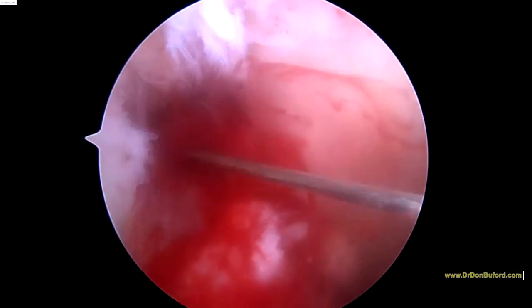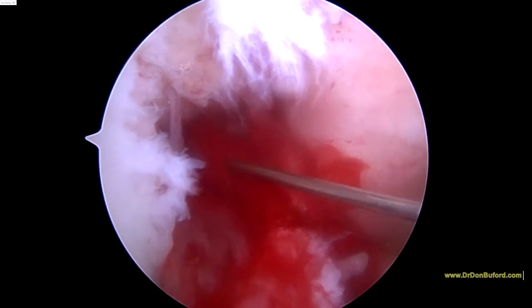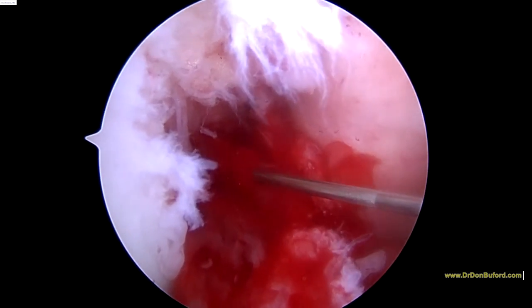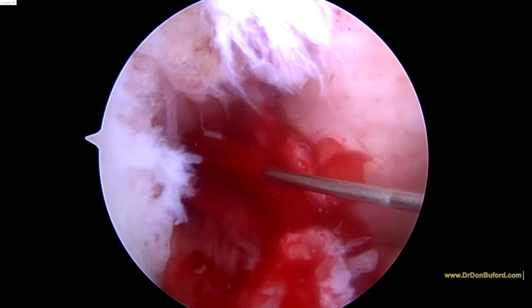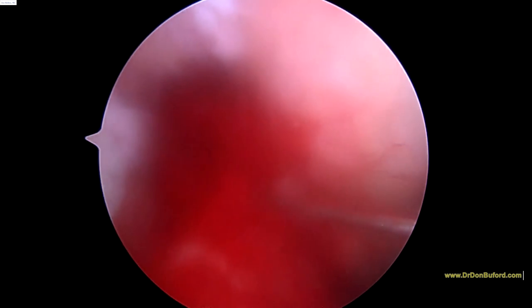Now the real tricky part for us, because we're not using fluoro, is to get way up at the insertion site, up on the femoral side. I can feel the wall so I know where I'm at. As we just slowly back out, we can see that you can just kind of not only get it inside the ligament, but pepper it and treat this whole area.